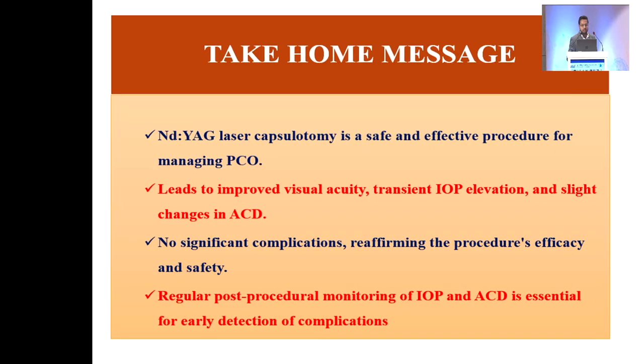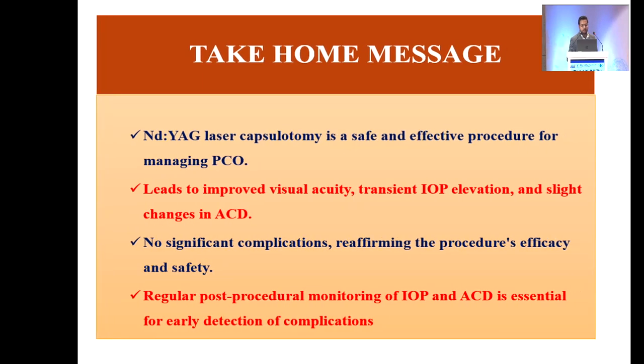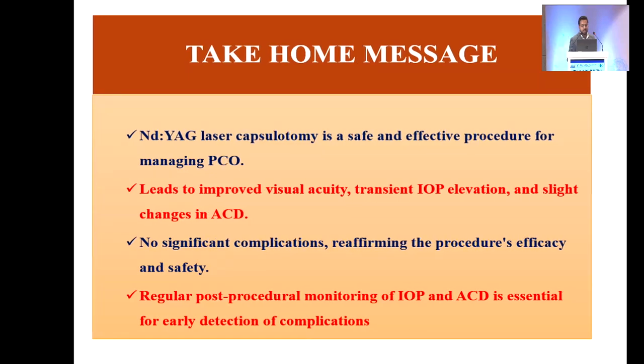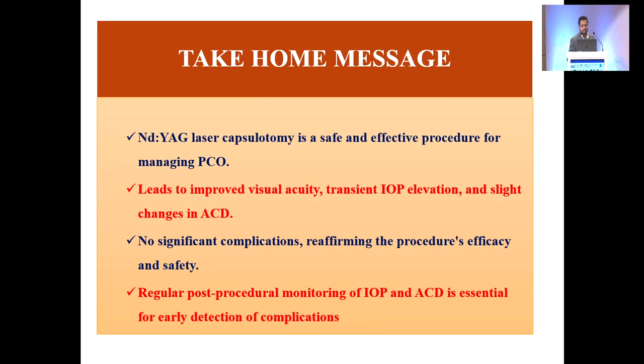As a take-home message, Nd:YAG laser capsulotomy is a safe and effective procedure for managing PCO. It leads to improved visual acuity, transient IOP elevation, and slight changes in anterior chamber depth. There is no significant complication, reaffirming the procedure's efficacy and safety. Regular post-procedural monitoring of intraocular pressure and anterior chamber depth is essential for early detection of any complication. Thank you.